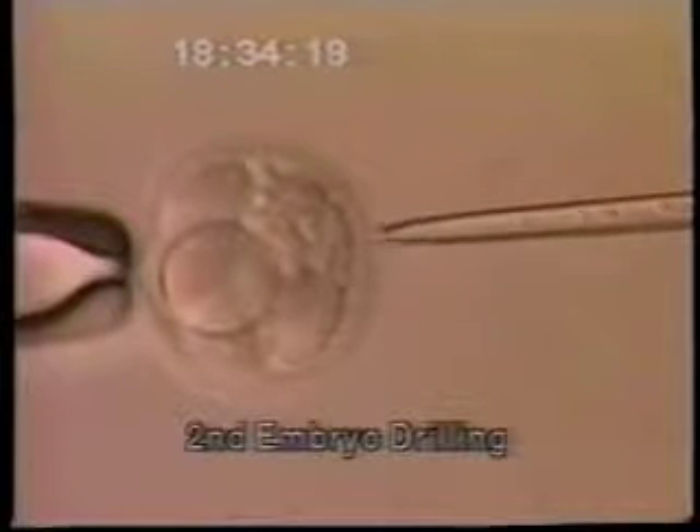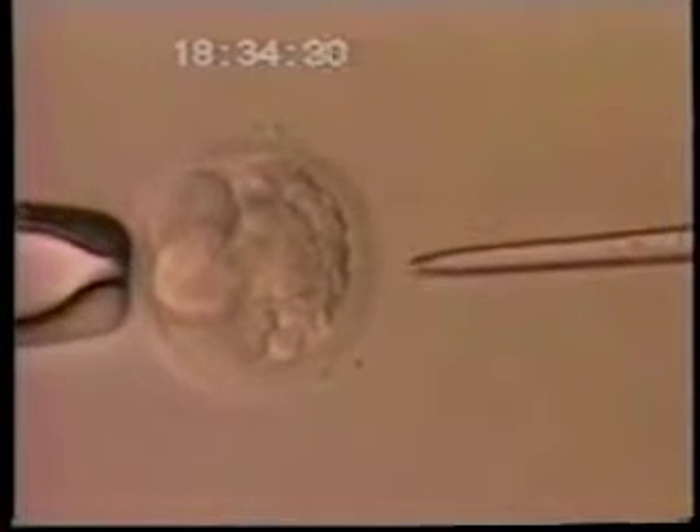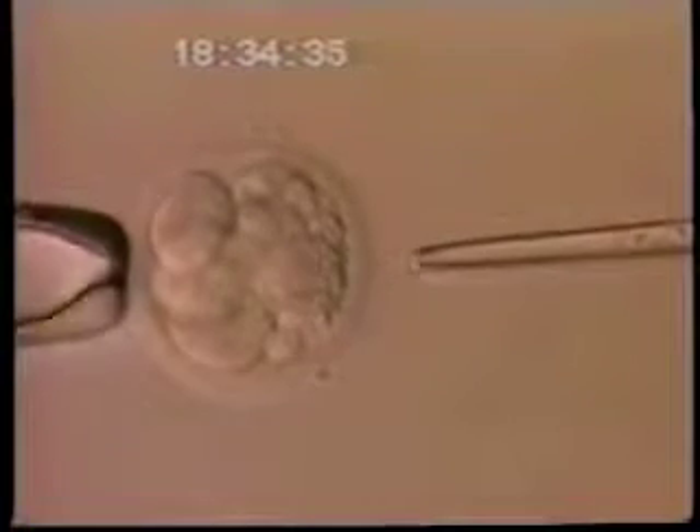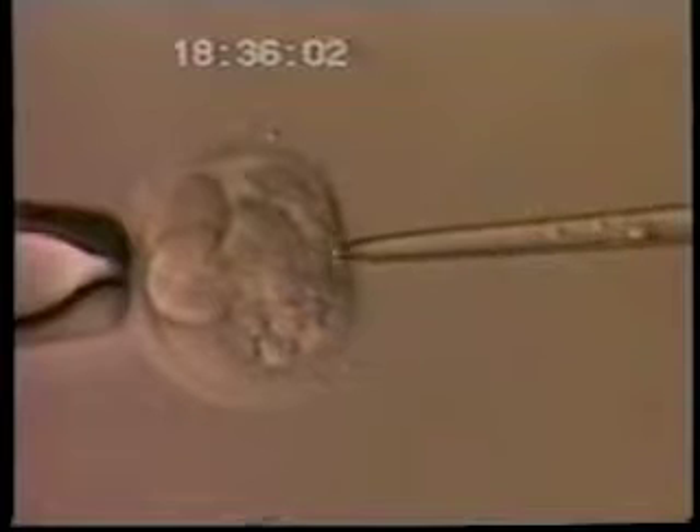Now you'll notice a second embryo in which there is more fragmentation that is obscuring the view of all eight cells. We're going to make our hole in the outer shell — the zona pellucida — right over this area of fragmentation. The fragmentation is just cellular material that can never result in any baby. That is why, if we have a choice, we try to make the hole right over that fragmented material so there's no chance we'll damage any of the true blastomeres. Once we make the hole, we can remove those fragments to get a better view of the embryo.